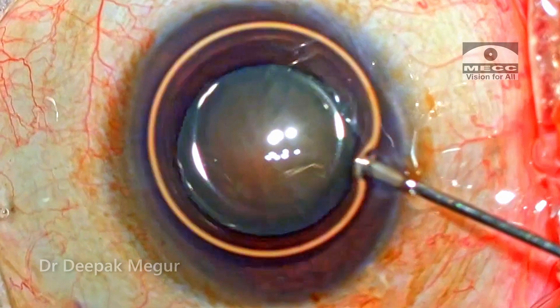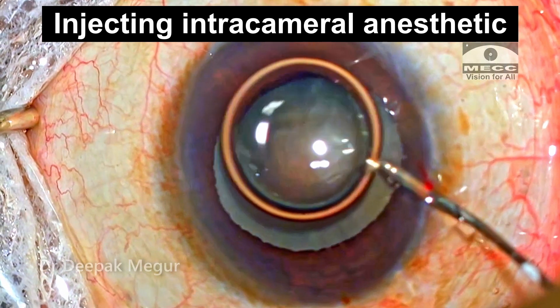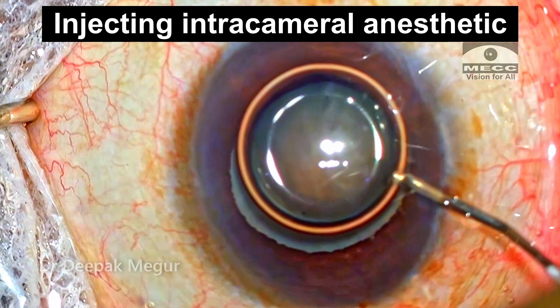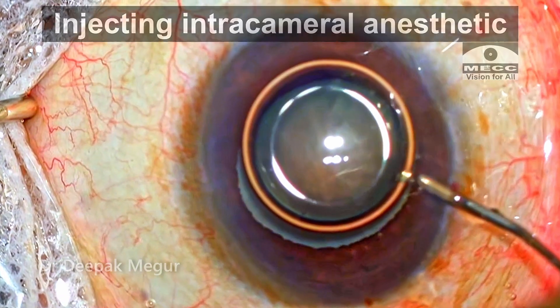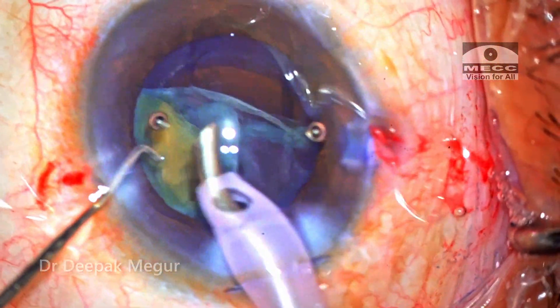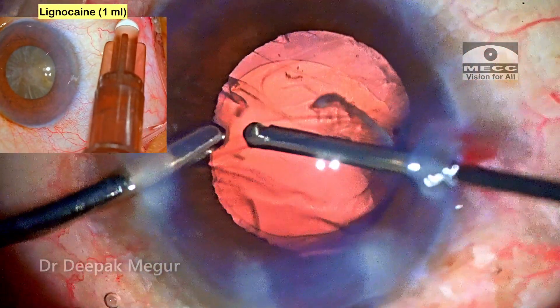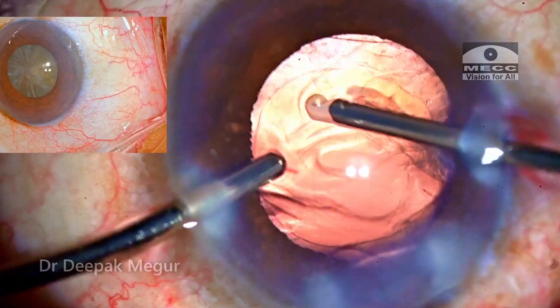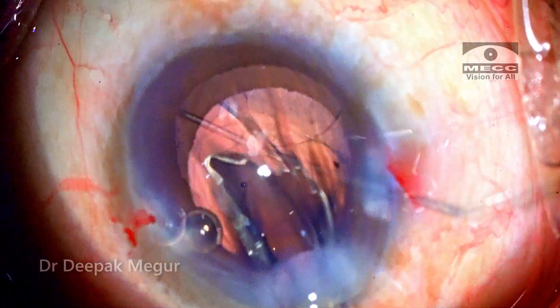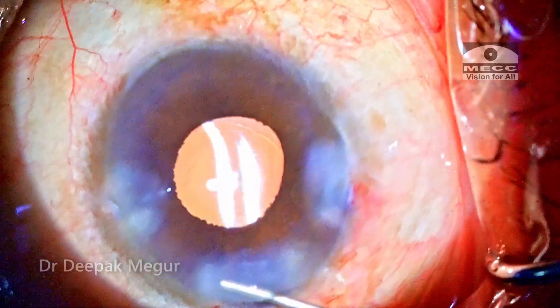The most common question asked is how we manage a posterior capsule tear when the patient is on topical anesthesia. If you have a patient as cooperative as this, using additional intracameral anesthetic in between can complete the procedure with no injections at all. In the event the patient is uncomfortable because the procedure is taking more time, I would consider giving a posterior sub-Tenon's 1 ml injection of lignocaine to ease the patient's comfort — but it was not required in this patient. The entire process was completed under topical anesthesia with supplementation of intracameral anesthetic.